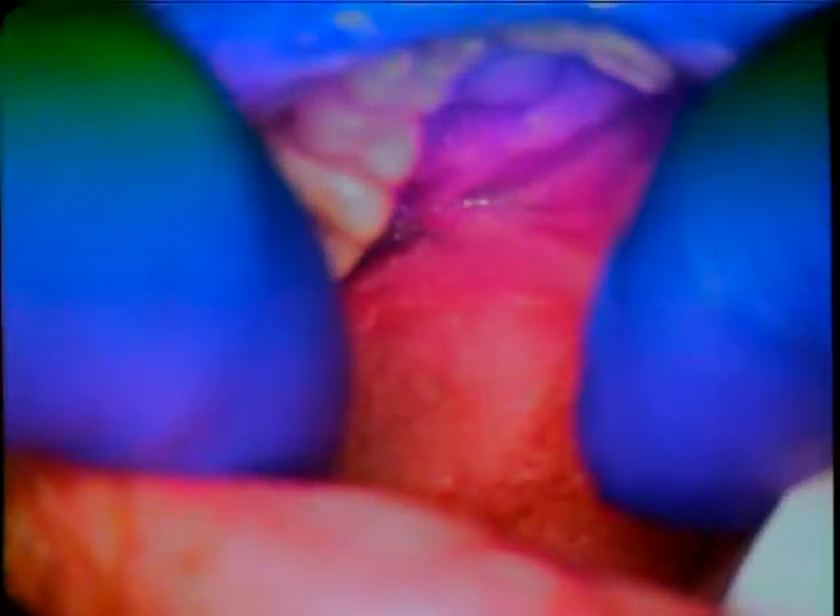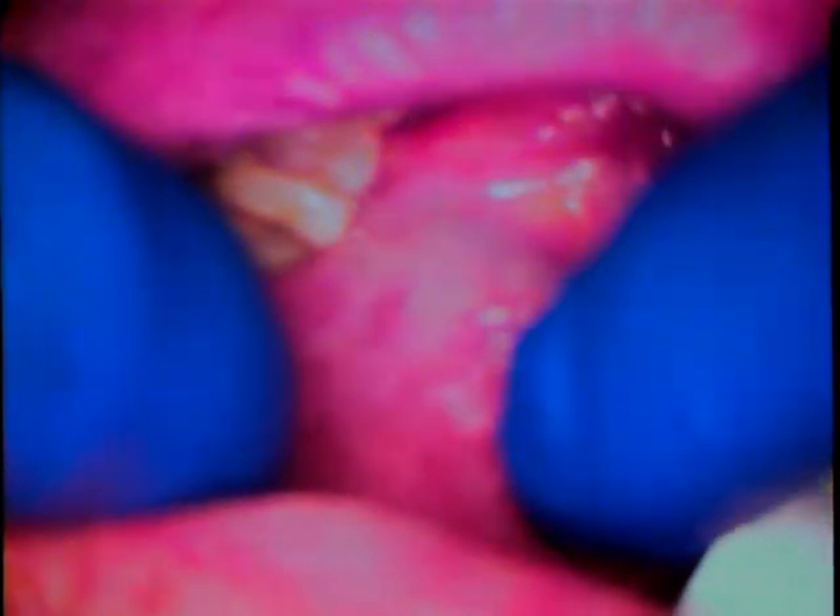We're going to head on over to this site and we're going to use something called a micro suction. I'm going to let Ron close a little bit, then open, and then rest a little bit. Muscles get tight — you've got to loosen them up a little bit.